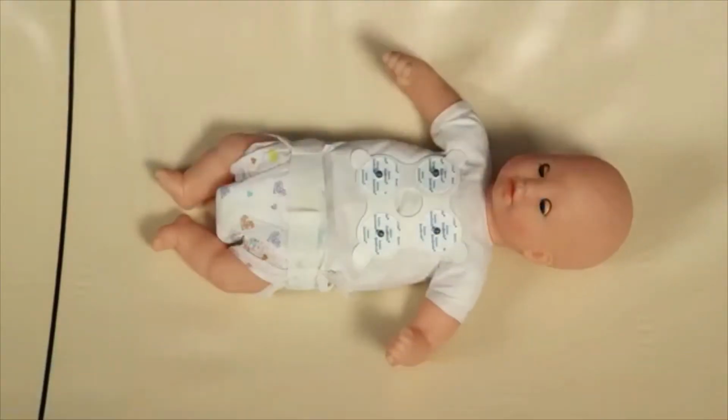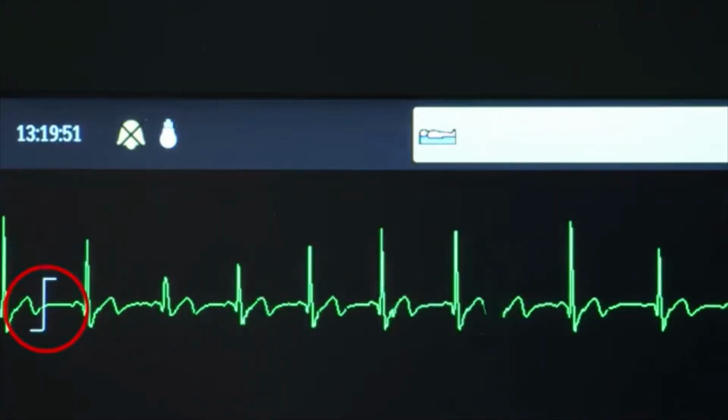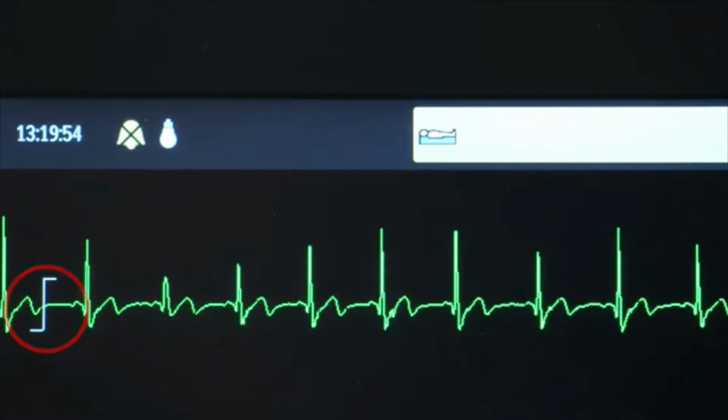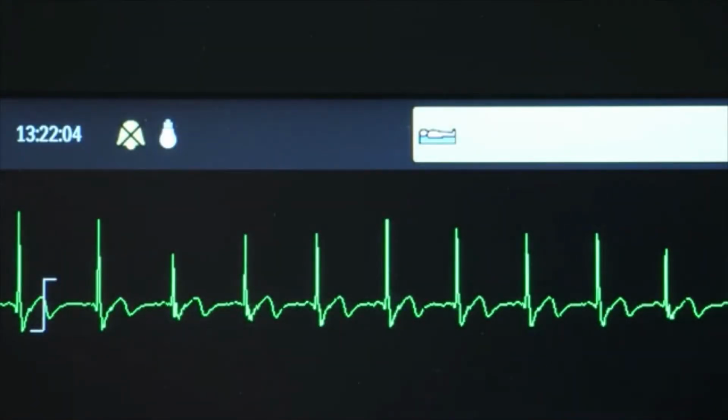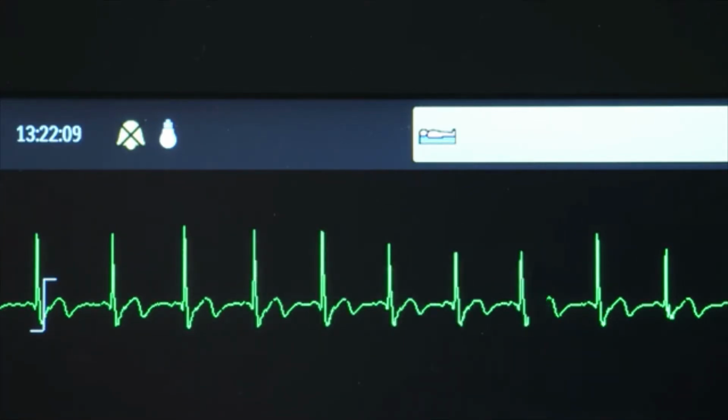Once you have placed the quattrodes, you will want to refer to the ECG reference line on the MR400 to see if you have good signal strength. It should be at least 1 millivolt. That is, the waveform should be equal to or greater than the size of the scale indicator.